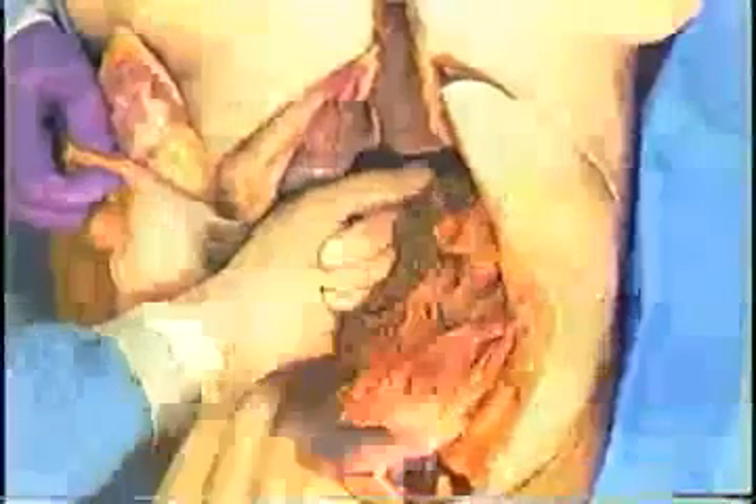In order to complete our vascular control of the liver, we're going to need to do a Pringle maneuver. The Pringle maneuver is used to control the pedicle of the liver. It's done by inserting your index finger behind the duodenum into the foramen of Winslow. You follow the lateral edge of the gallbladder down and fall into the foramen of Winslow. I'm going to poke my finger through here, through the lesser omentum. That allows me to get my finger completely around the pedicle of the liver.